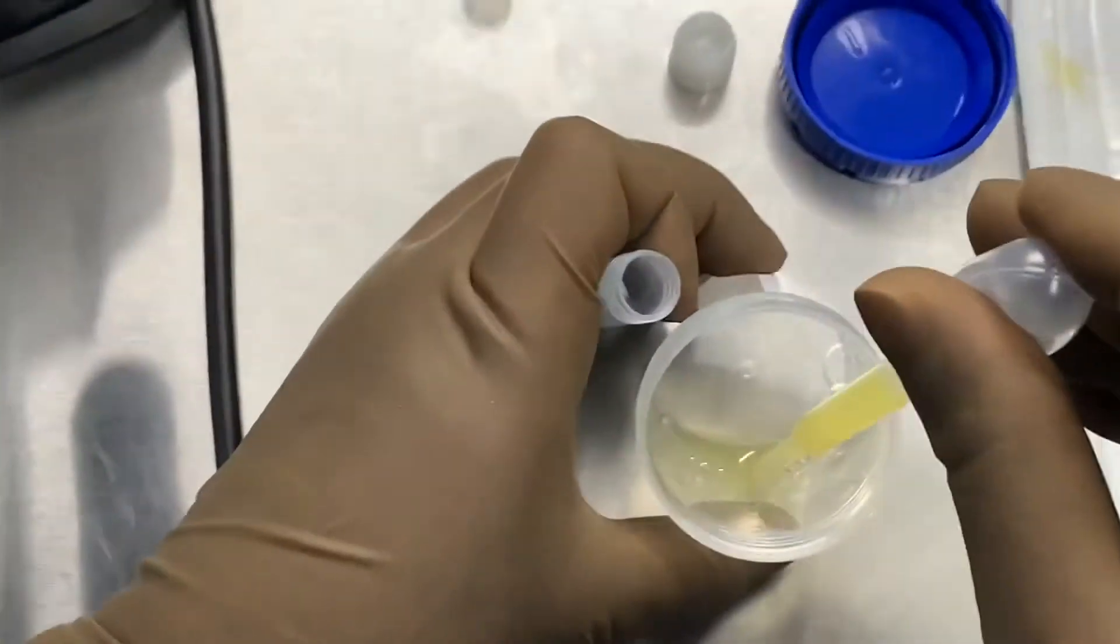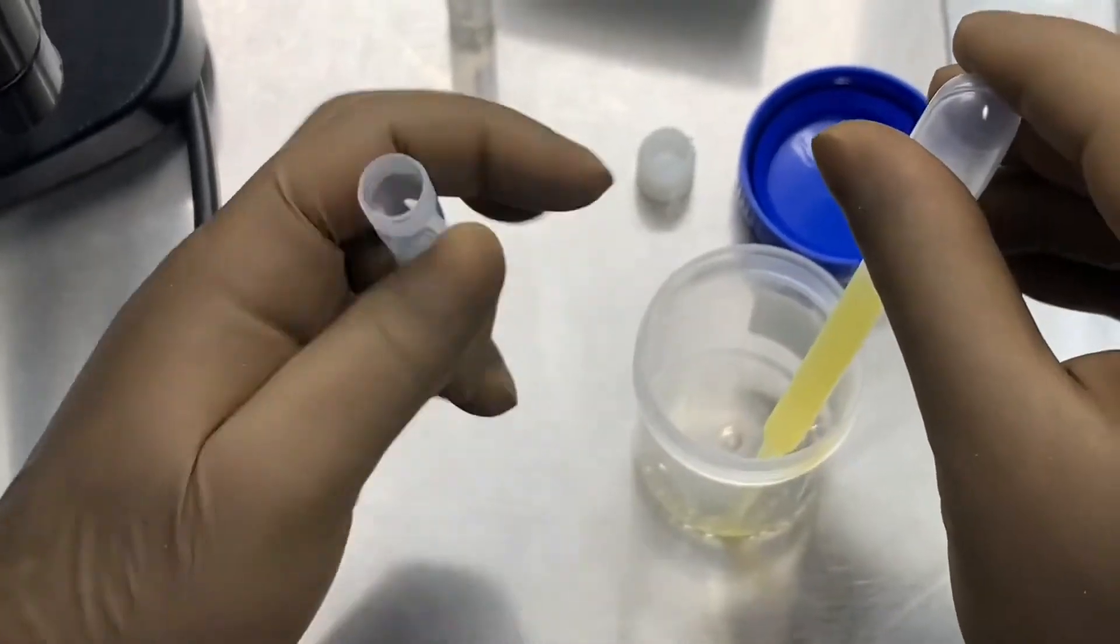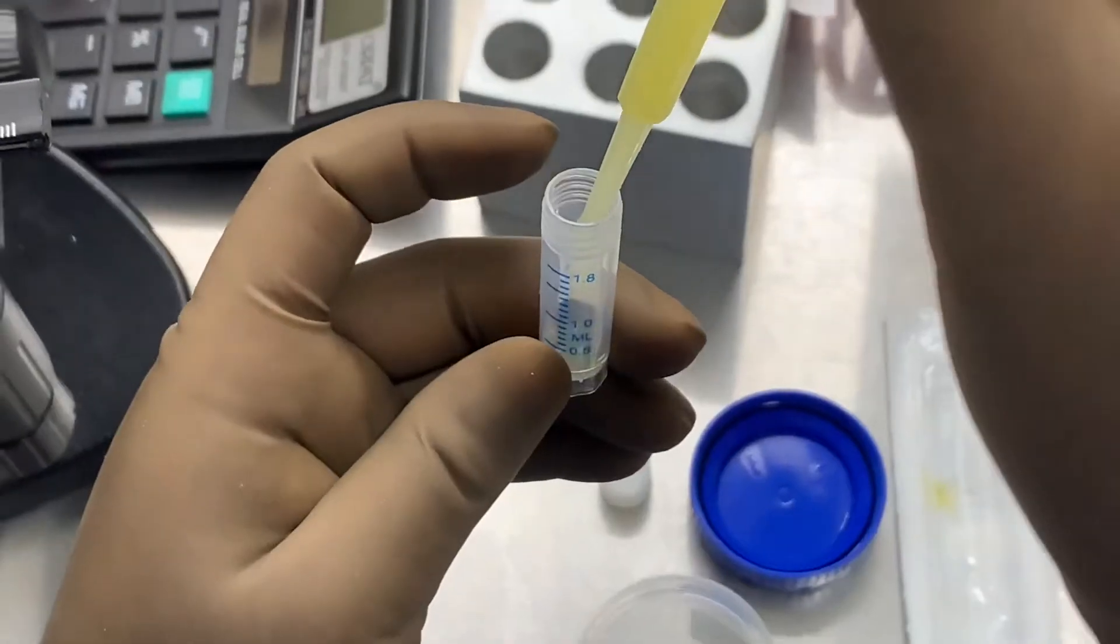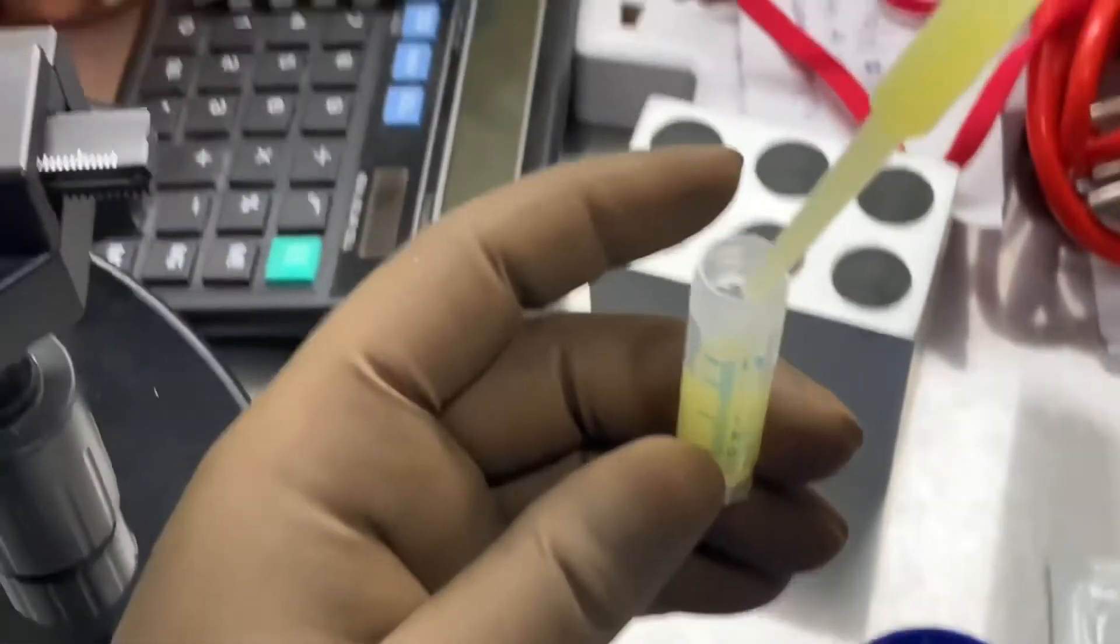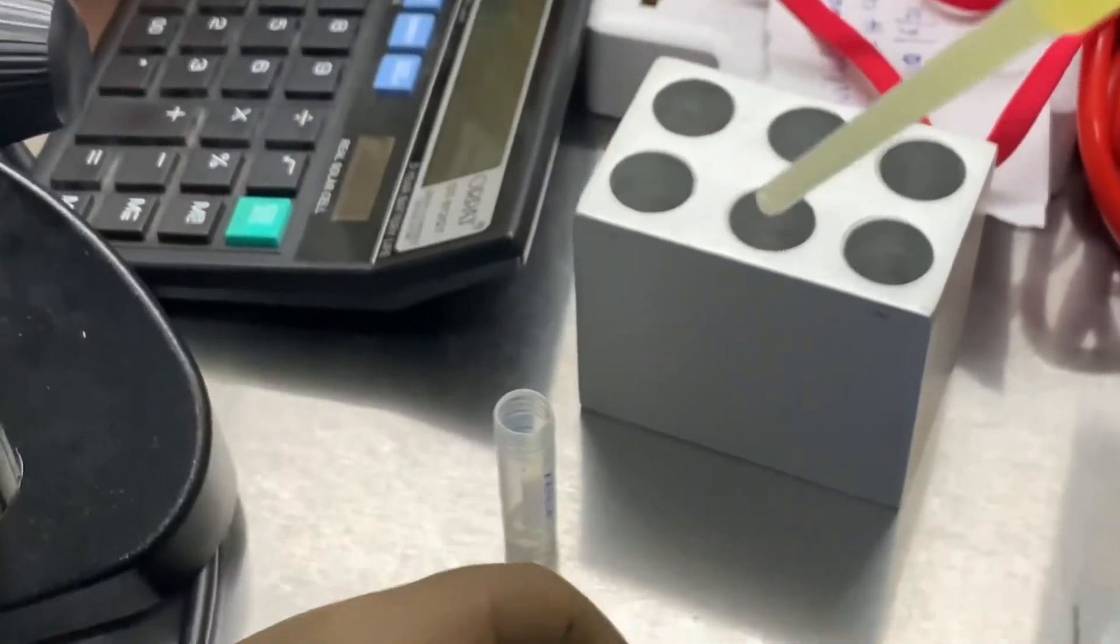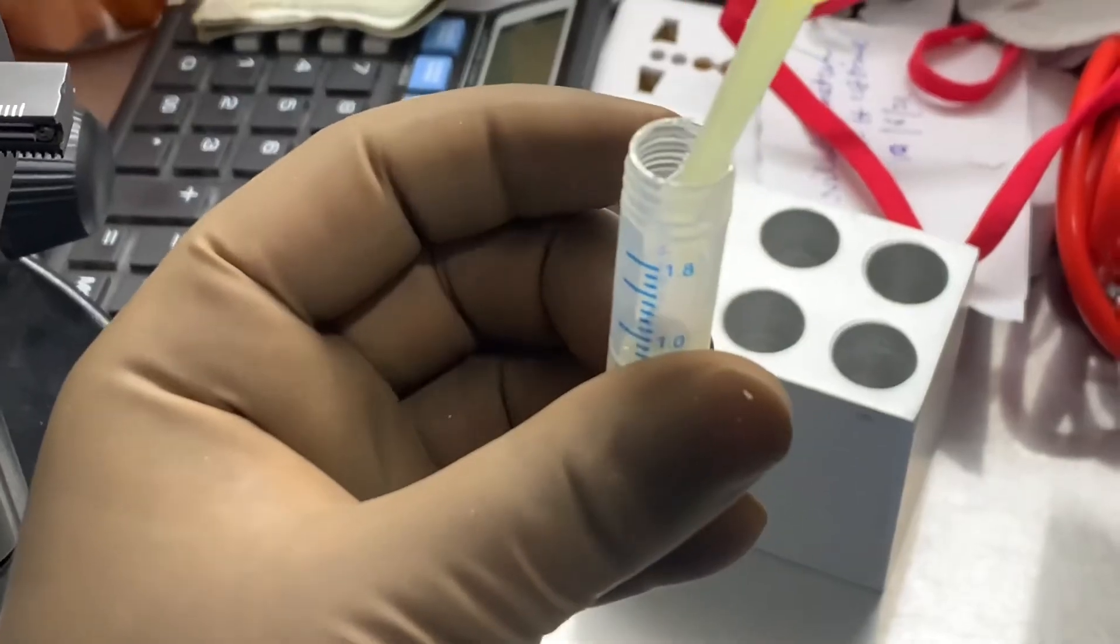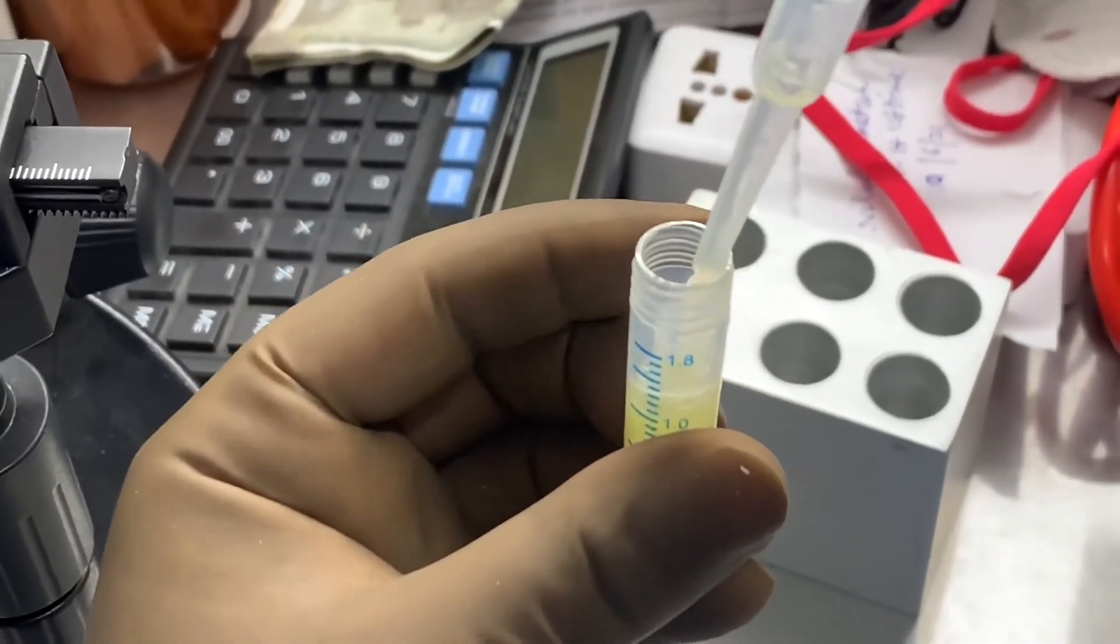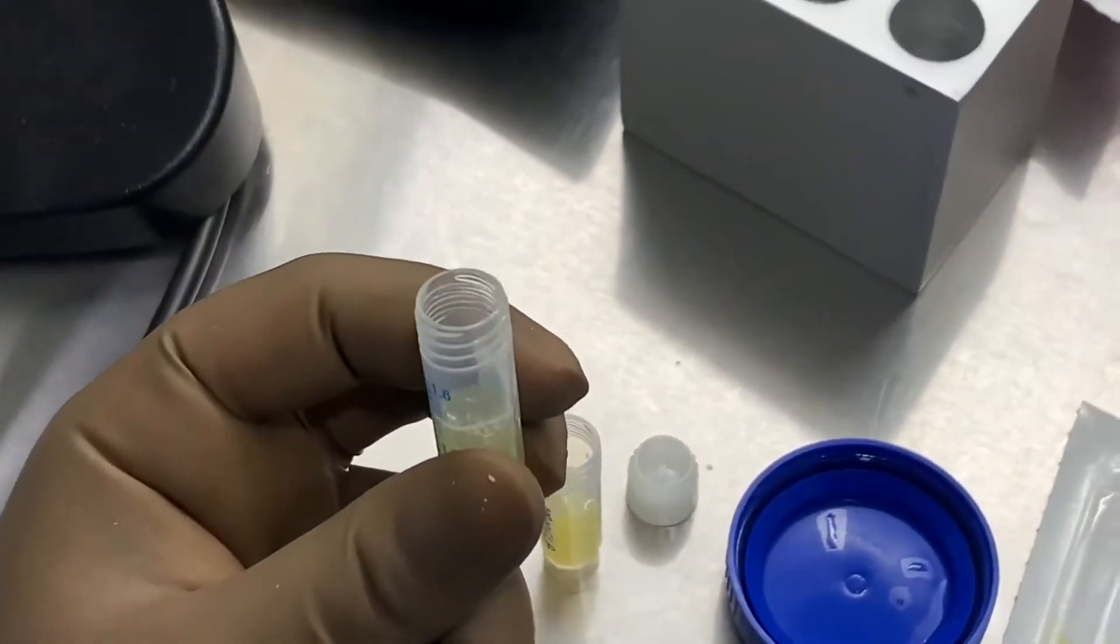Then the semen is properly mixed with cryoprotectant and needs to be kept inside the cryovials. This is the cryovial of 1.5 ml volume. This mark is properly seen over here. We should not keep more than that mark so that the semen once it will be cryofrozen, the volume will be increasing and it will break the seal of the cryovial.